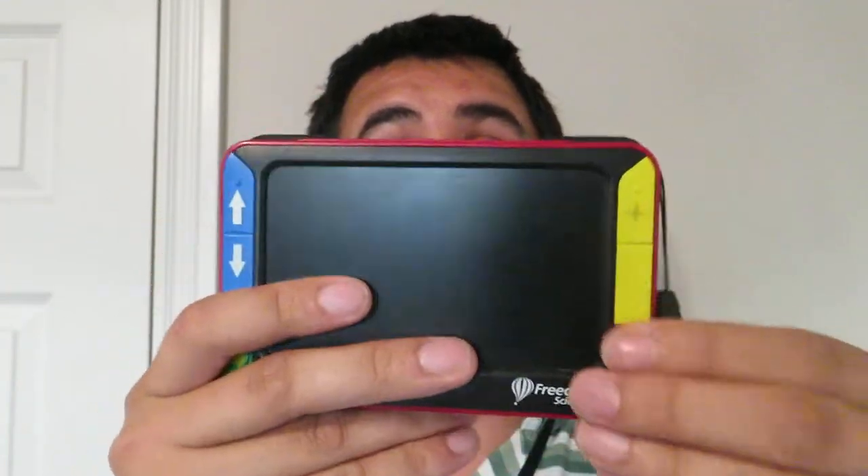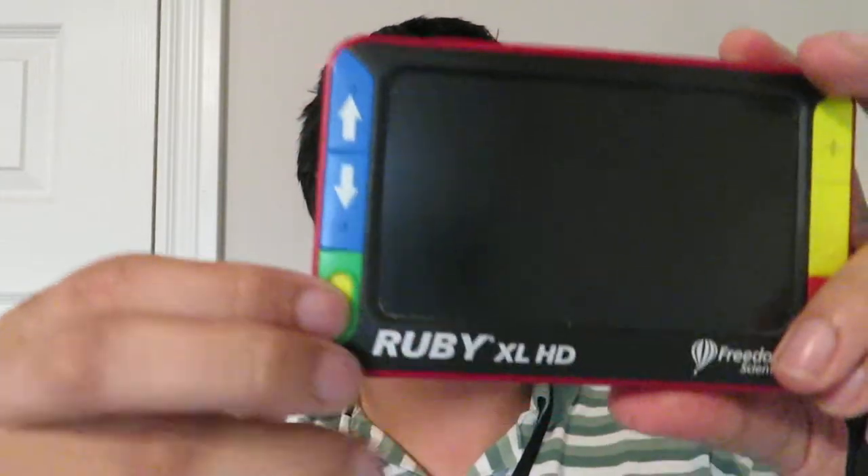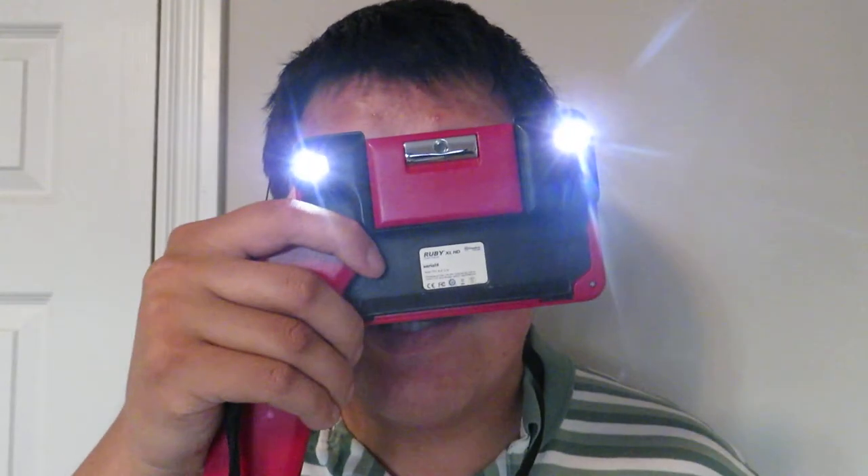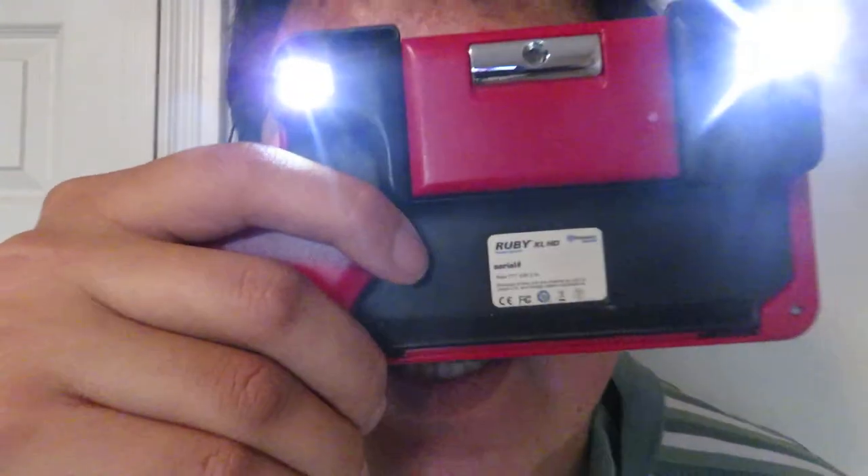I got this portable CCTV because of strangers from this thing we call the internet. Maybe you're a stranger right now — maybe we've never talked. Anyway, it's this device right here, and it basically turns on with this switch right here. When it turns on, it becomes a portable digital magnifying glass, so I can just look through it. I can see myself through the camera, and it's got these lights right here.